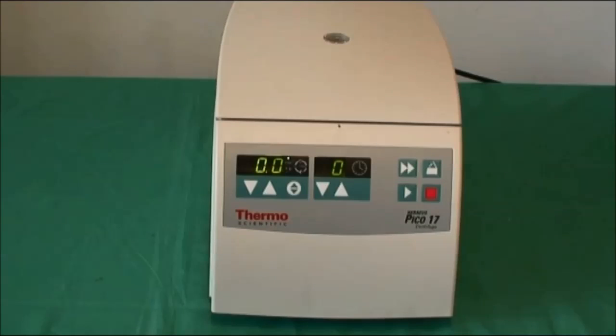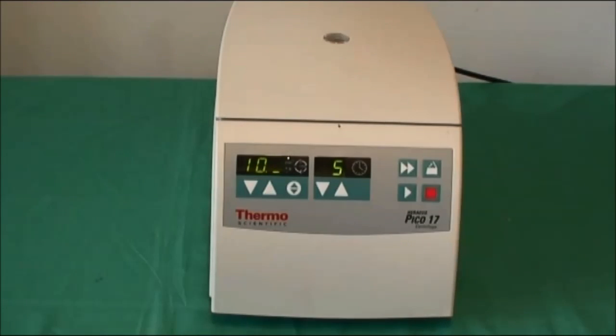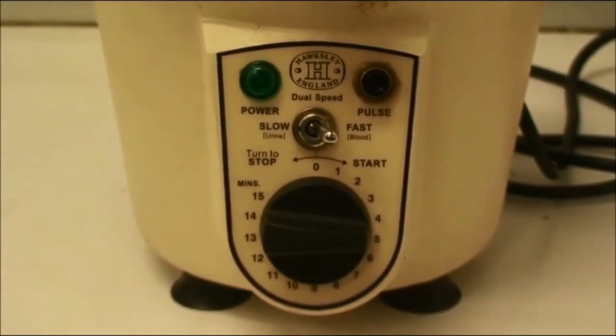The settings for the micro-hematocrit centrifuge will differ depending on the centrifuge model. They should be set to spin at either 10,000 RPM for approximately 5 minutes, or on fast for approximately 5 minutes.